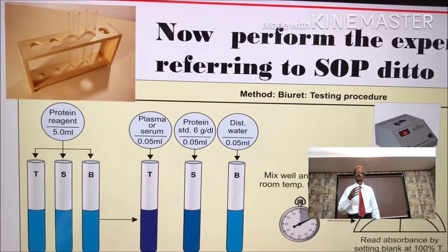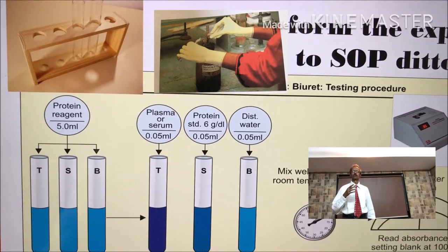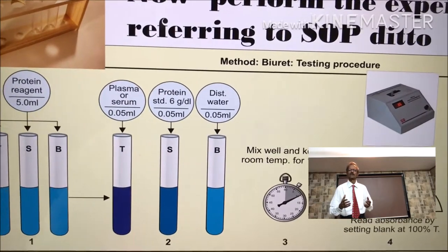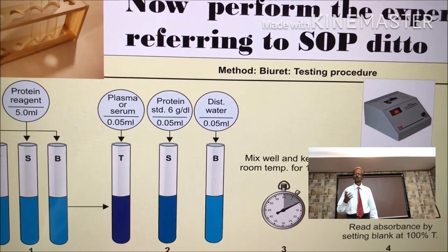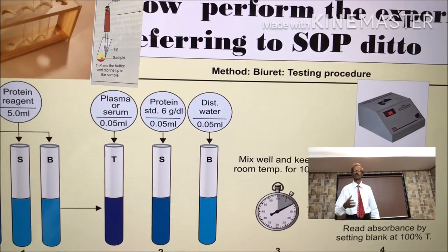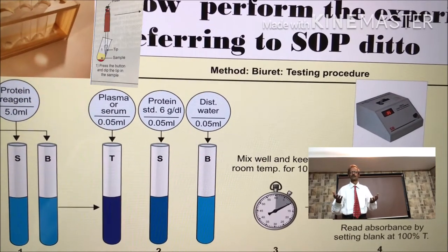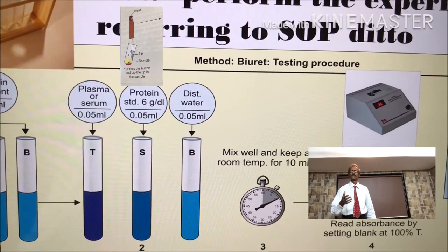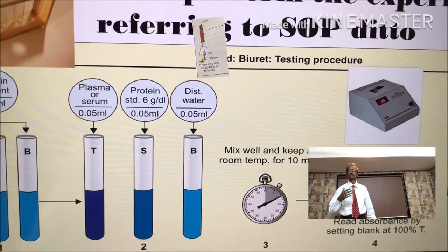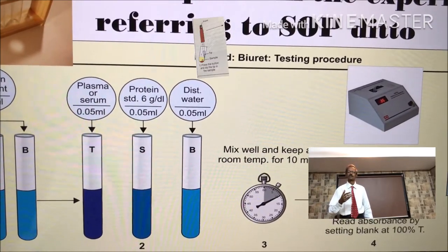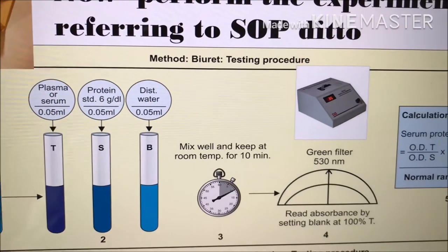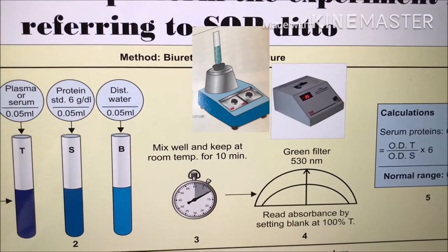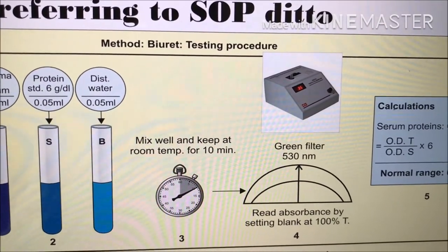In each test tube, by using the dispenser, add protein reagent 5 ml. Then in the test tube T, add serum 0.05 ml. In the standard, add protein standard 0.05 ml. And in the blank, add 0.05 ml distilled water. Mix well the contents in the tube and keep at room temperature for 10 minutes precisely.